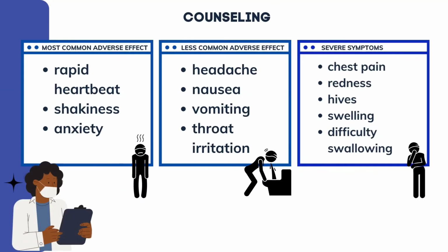Keep in mind that in some people who use nebulizers, there are some negative effects that can arise: rapid heartbeat, shakiness, and anxiety are the most common adverse effects. Headache, nausea, vomiting, and throat irritation are the less common adverse effects.